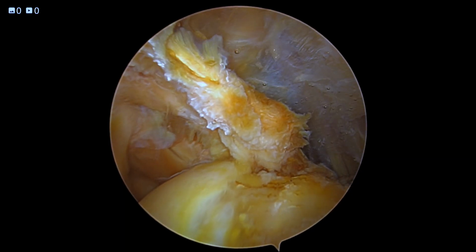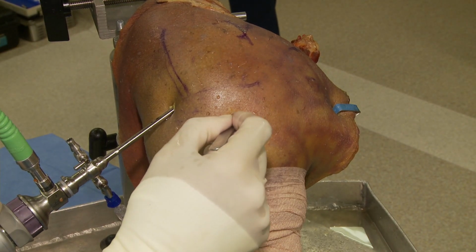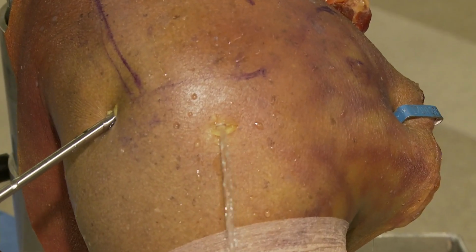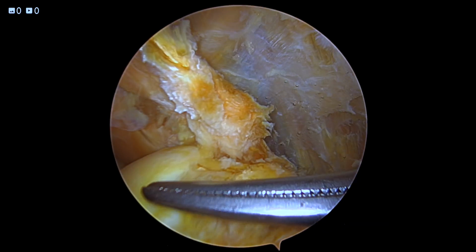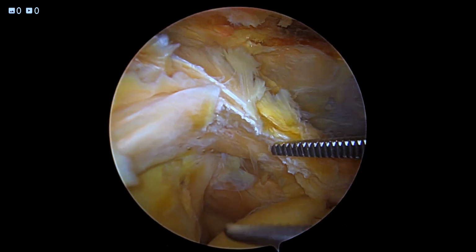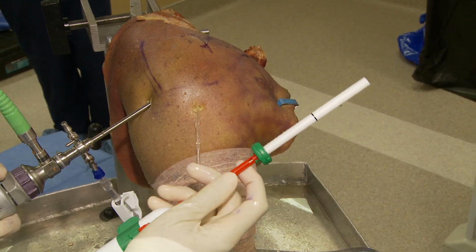Okay, so now we're ready to come back to the shoulder and actually place the device in the subacromial space. The first thing that we're going to do is just slightly expand our lateral subacromial portal. I would say that you want it to be approximately 1 centimeter to maybe 12 millimeters. And then I'll actually use a hemostat that comes into the subacromial space, allowing me to dilate into the deltoid just to provide a clear pathway for the device to be implanted, as you see here. The next step is to actually take the device, bring it to the field.